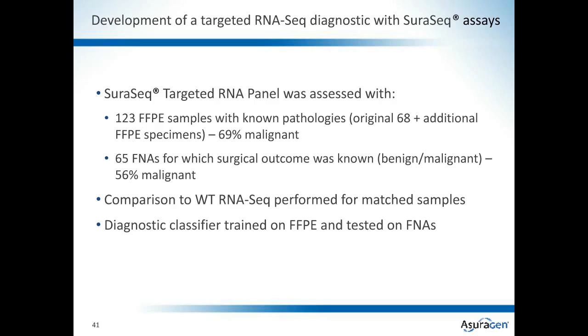The second cohort that we applied this targeted RNAseq panel to was a set of 65 fine needle aspirates for which surgical outcome was known. The overall prevalence of this cohort was 56% malignant.